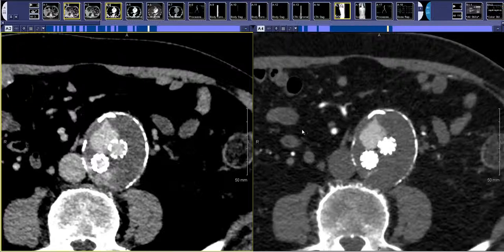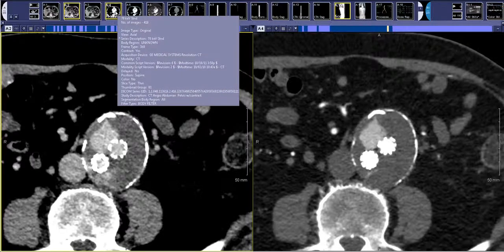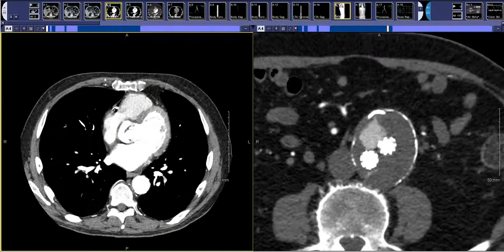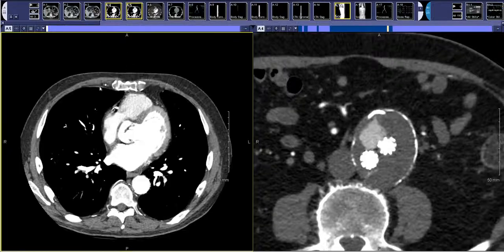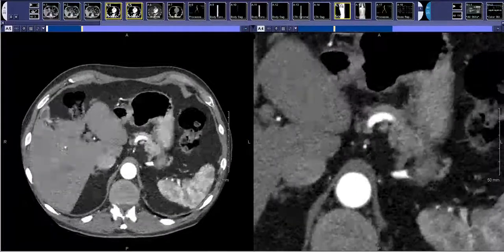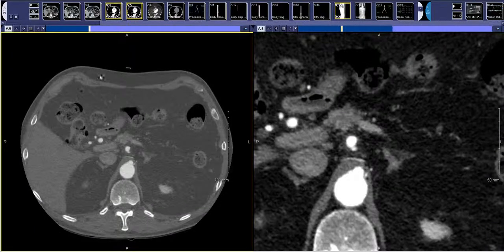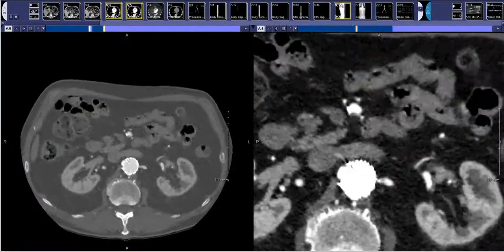This CT scan was done with dual energy, so you have some additional sequences. A dual energy scan has a couple of labeled series. The first is called 70 keV — this is just a standard CT scan reconstructed at what you would typically see for a single phase study. A 55 keV is at a slightly lower energy level, which really makes the iodine in the study pop out.